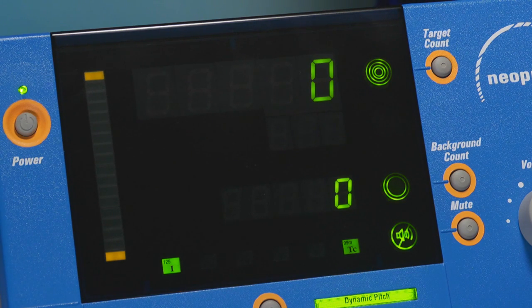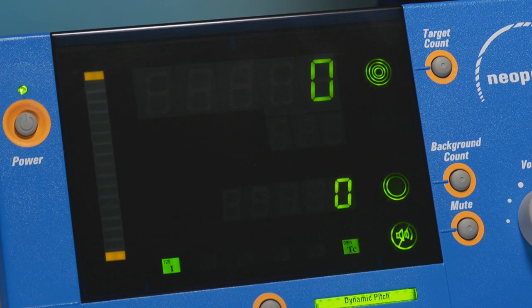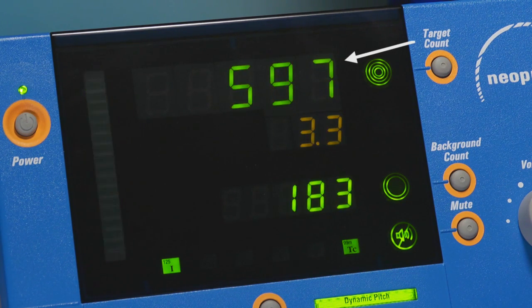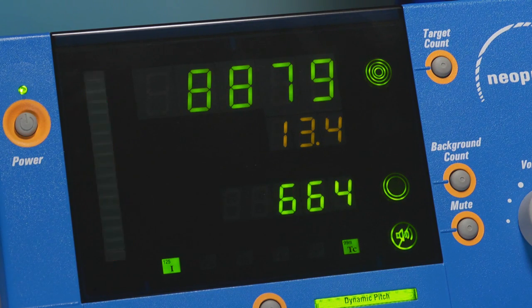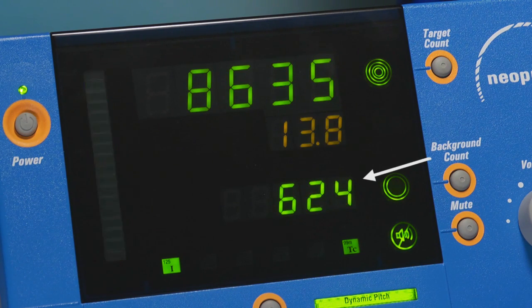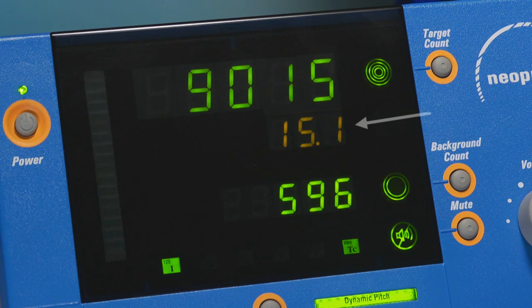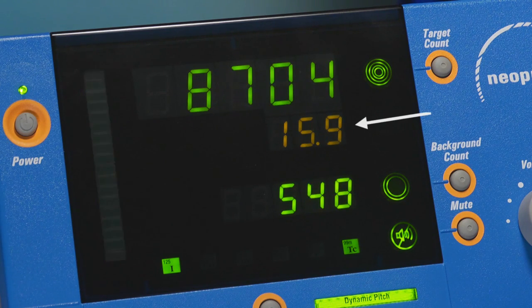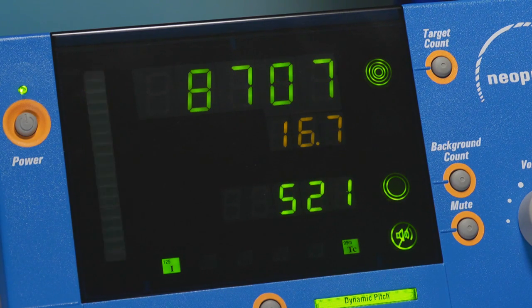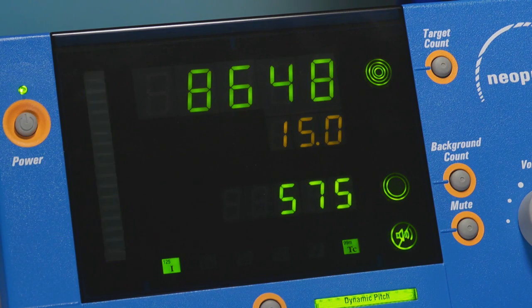In dual isotope mode, the detected count range for technetium-99 is displayed in the target count display. The detected count range for I-125 is displayed in the background count display. The ratio of these counts is displayed in the ratio display. The target count feature is only available for technetium-99 energy range.